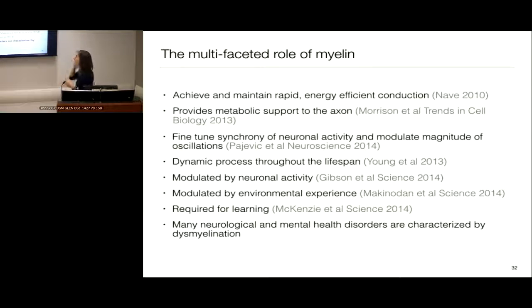It's also a very dynamic process. Most of you myelinate very fast during the first 2 years of life, such that by the age of 2 you get the contrast in the image that you see in an adult. But your brain continues to myelinate throughout your life, and you only achieve a peak in myelin content, I think, in your 30s or 40s.